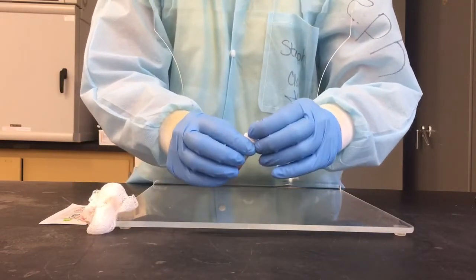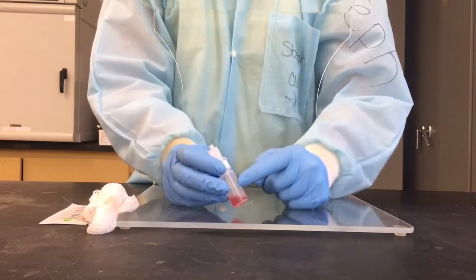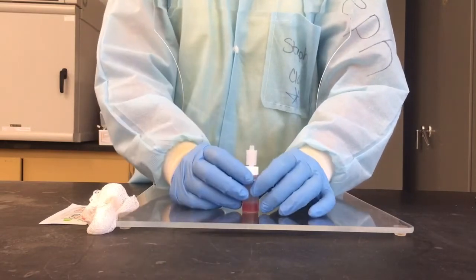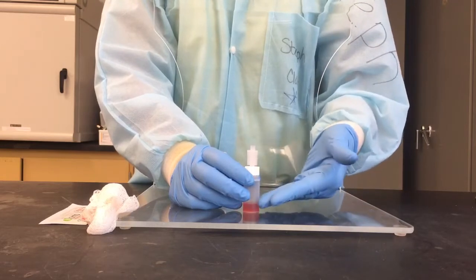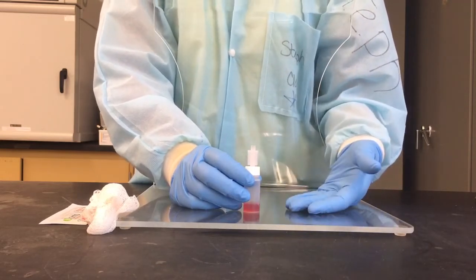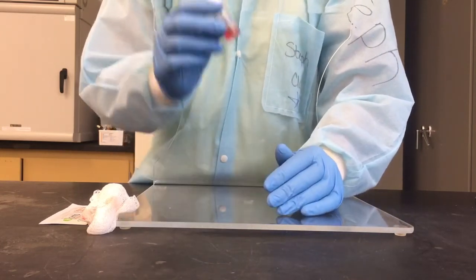So once your specimen is well mixed like this, you're going to put your name or your initials and the patient number that you put together on the side of your tube, and then you're going to put it on the rocker and let it sit for 10 minutes. This is to ensure that all of your cells get mixed with all of the diluent to allow time for lysis and to give yourself an adequate specimen to be able to count.